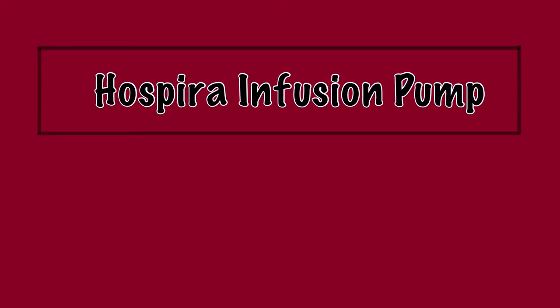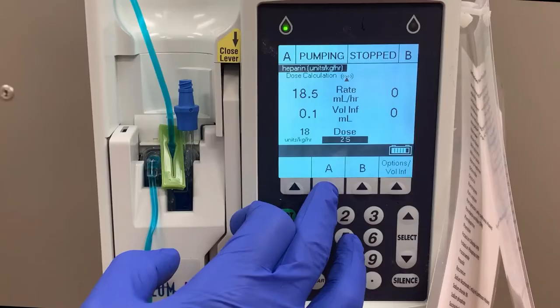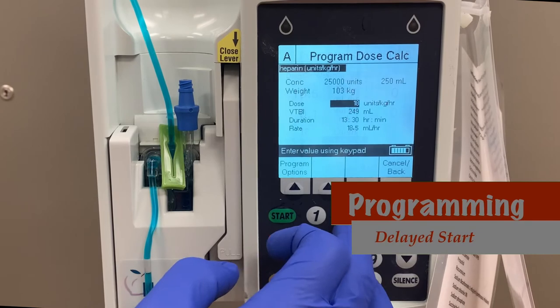In this video, we will look at the Haspira Plum A-plus infusion pump and some different methods of programming medications. When administering some medications, it is sometimes necessary to pause the infusion for a certain time period. With these instances, you can utilize the Delayed Start program.